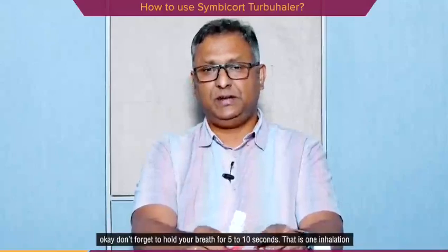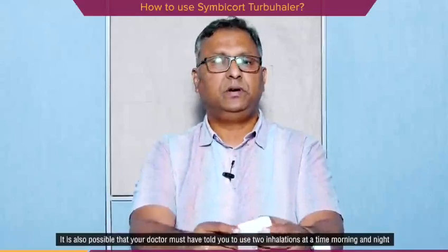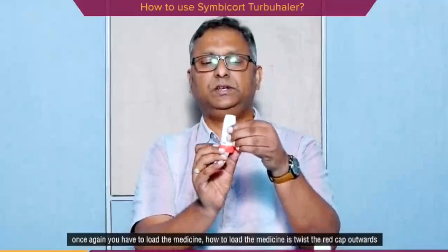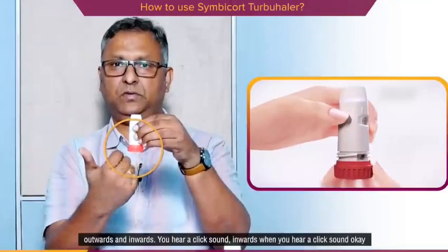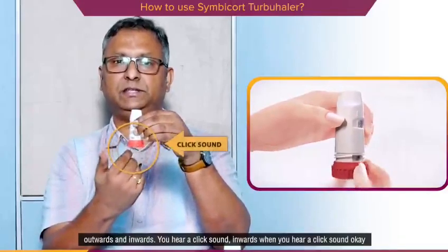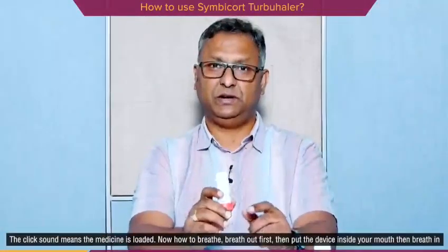That is one inhalation. It's also possible that your doctor must have told you to use 2 inhalations at a time, morning and night. So if you have to use the second inhalation, I will show you again. Once again, you have to load the medicine. How to load the medicine is, twist the red cap outwards, and inwards. You hear a click sound. Inwards when you hear a click sound. Okay? The click sound means the medicine is loaded.